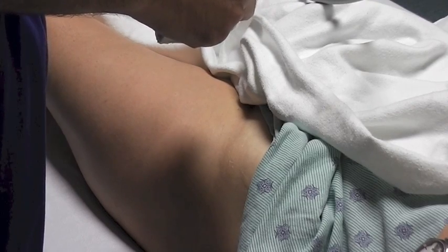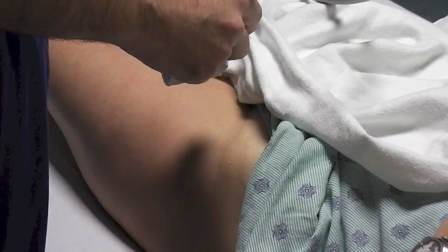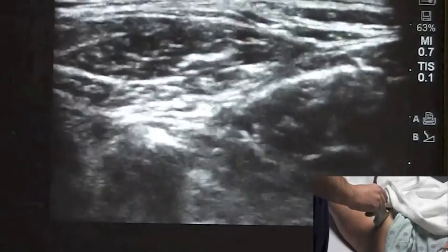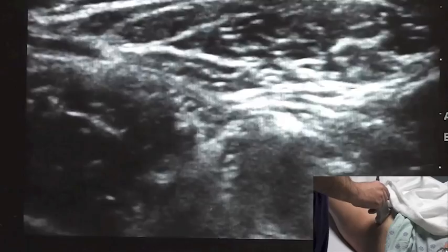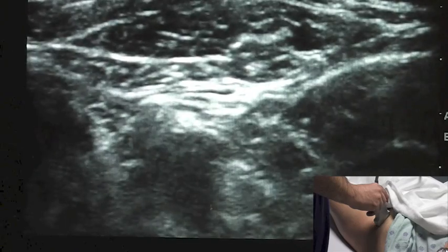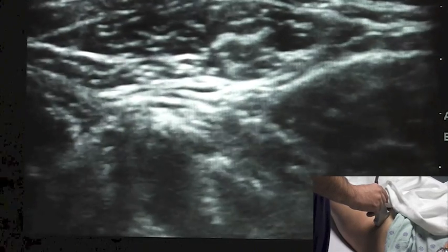For doing our femoral nerve block, I have the patient lying in supine position. I'm going to be placing the ultrasound probe essentially right near the inguinal crease. What I'm looking for first, because it's a great marker, are the femoral vessels. I don't see anything in this scan, so I'm going to start approaching medially, taking advantage of the anatomy we know, so that the nerve will sit lateral to the femoral vessels.